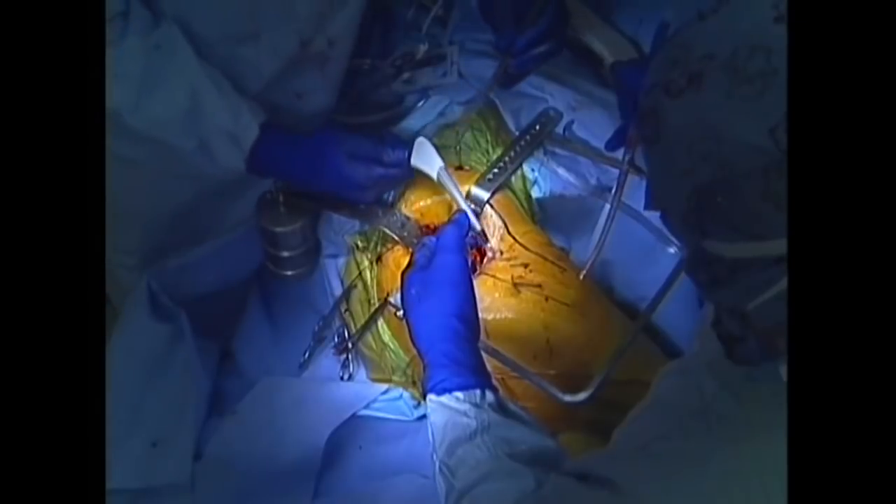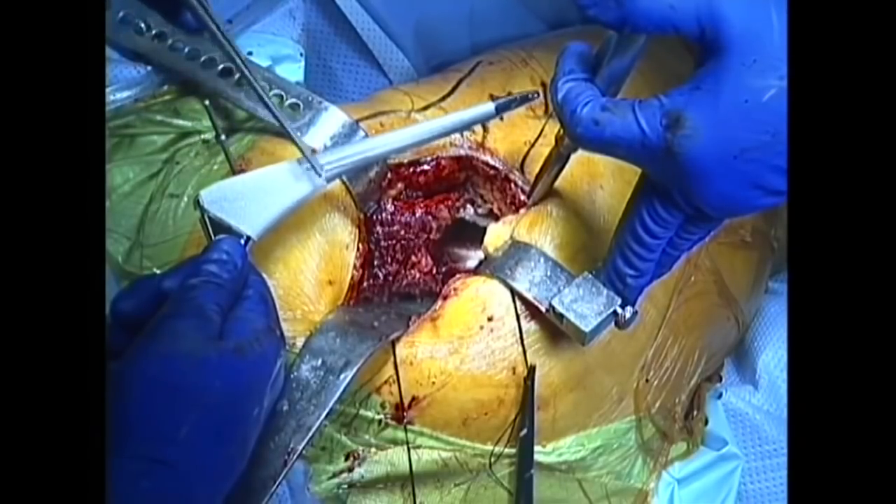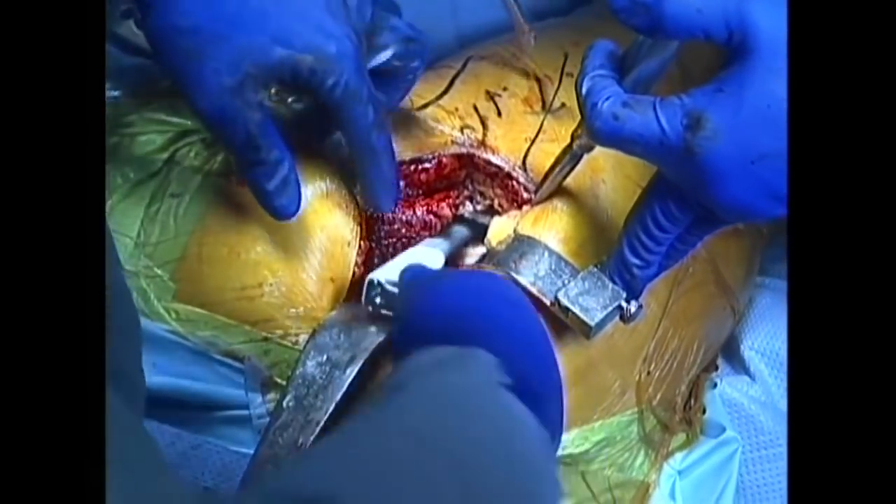The permanent femoral stem is now impacted into place. The stem is coated with a porous surface to allow fixation of the prosthesis with an ingrowth of bone.